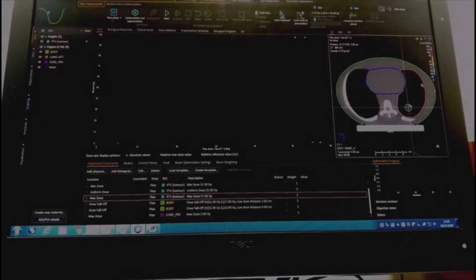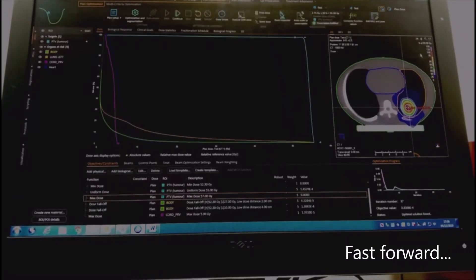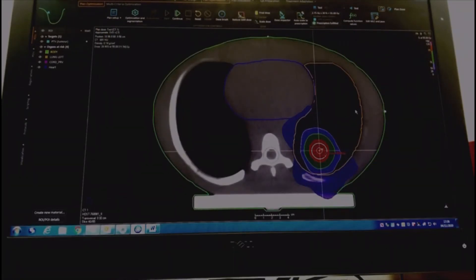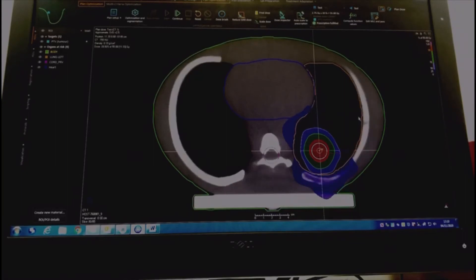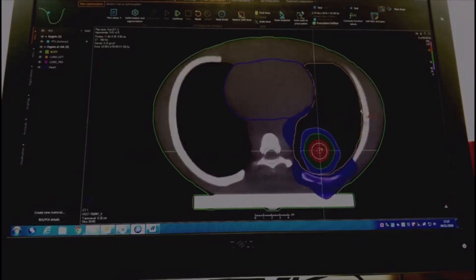I am using some software that will help me design the radiotherapy treatment. Here you can see a little map of the amount of radiation energy deposited in the plan that I've just designed.